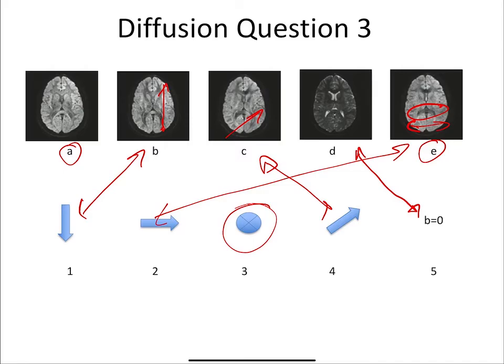Okay, and I think my question is kind of related to what you were saying earlier, because if someone has damage somewhere, it would also affect that area differently as well. Right. And it would depend whether or not CSF filled the space. Well, if there's any diffusion applied, CSF is just not even there, because the signal is just gone. Because the diffusion is so high, typically. So that depends on the b value, right? Typically, with the higher b values of say 3,000, CSF is pretty much gone.